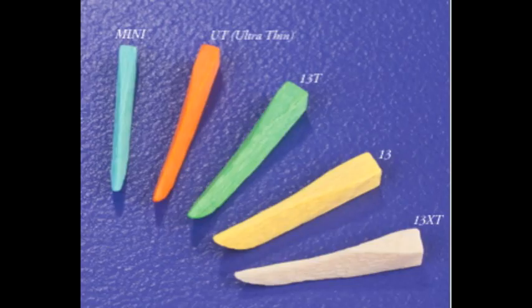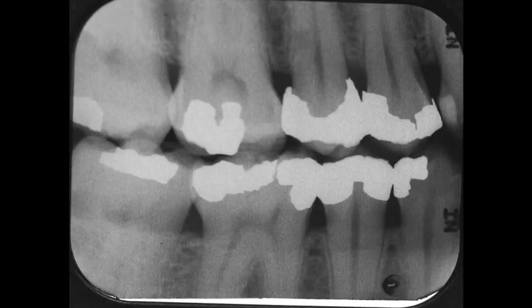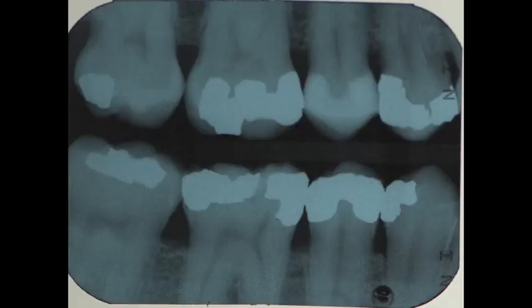The original dental wedge was designed to be placed between the teeth to prevent excess amalgam from being pushed beyond the gingival finish line and preventing an overhang. This patient presents with a chief complaint of chronic bleeding around the bicuspids, clearly a result of poor adaptation of filling material to the tooth itself. Almost every patient today desires white, colored, anatomic, and aesthetic fillings. The challenge when working with posterior composite is to obtain tight, plausible contacts.